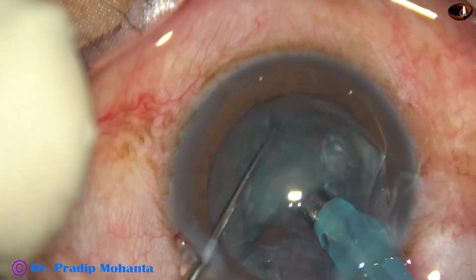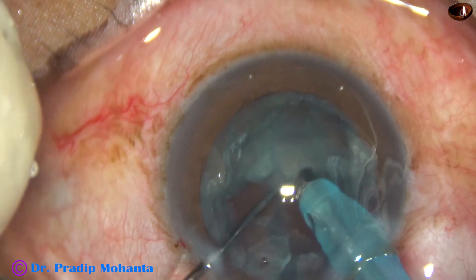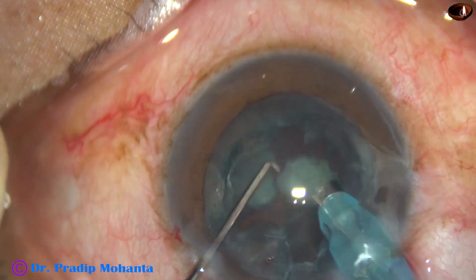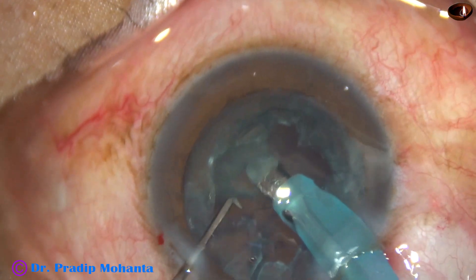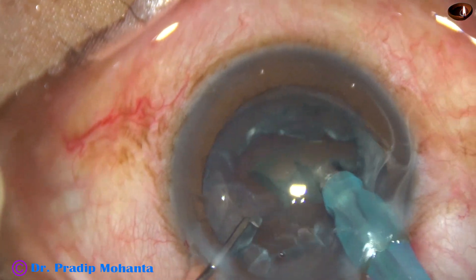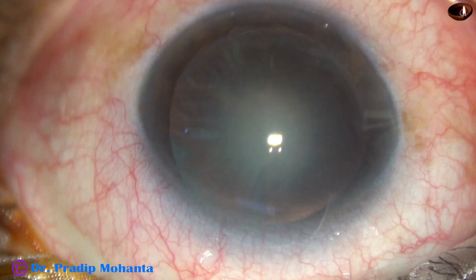Since no vacuum is used, this is known as mechanical chop. If we use vacuum in such cases to hold the nucleus, we will just remove the lens material in front of the FACO needle. So we cannot use vacuum in soft cataracts, but we can use this technique.